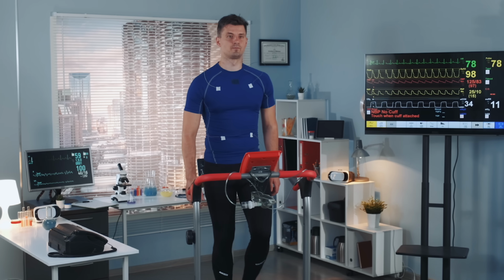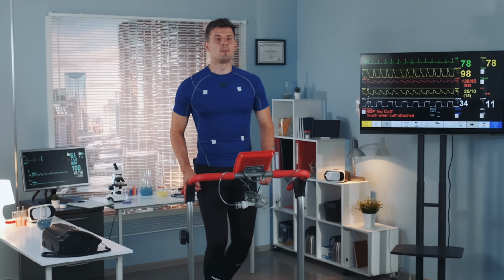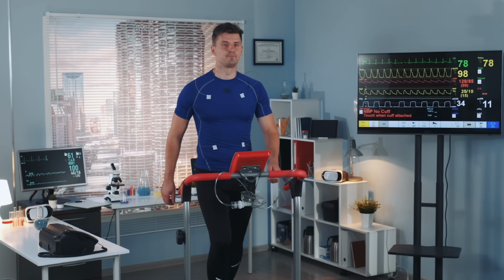For a stress test, what we're looking for is, are you going to develop chest discomfort? When you're developing chest discomfort, we look at the ECG tracing, because if there's a blocked artery, we hope to see that there might be an abnormality in that ECG, which will then answer the question as to whether your chest pain is coming from your heart or from something else.